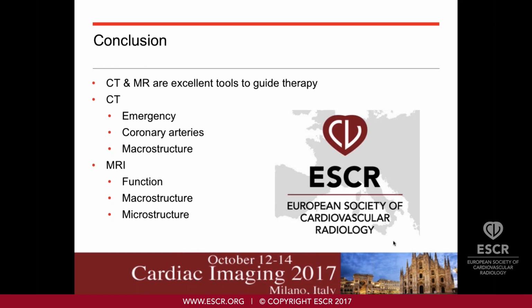Okay, thank you very much. I was thinking exactly about that. So we have two questions from the audience. The first one, a colleague is asking, can we please see an example of ellipsoid evaluation of left atria? My question is about the machines getting us those images.